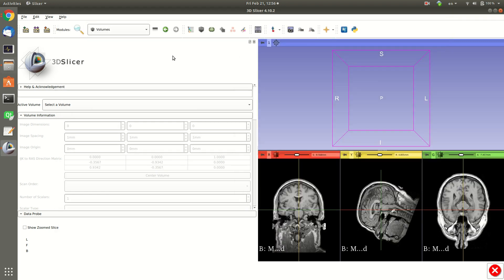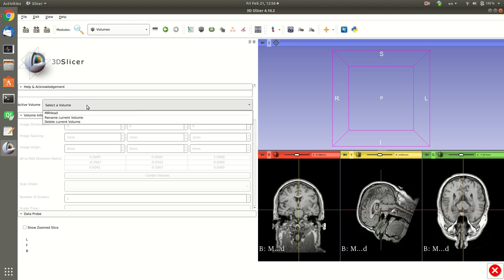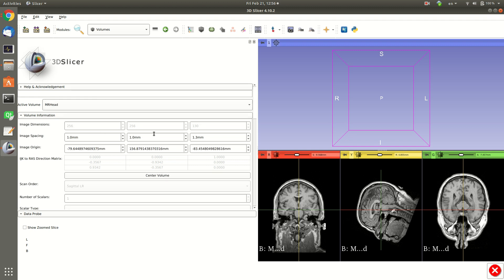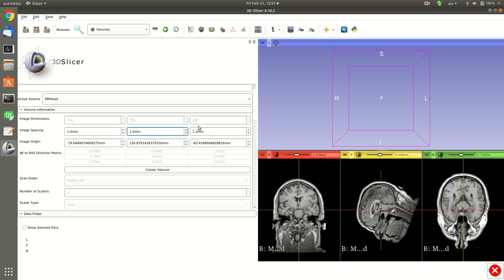Most of the images we get are not isotropic. This means if you go to volume then select the image, you can see here that we have more slices here and here but not in this direction. To make the image complete volume, to increase this, we usually apply resampling.